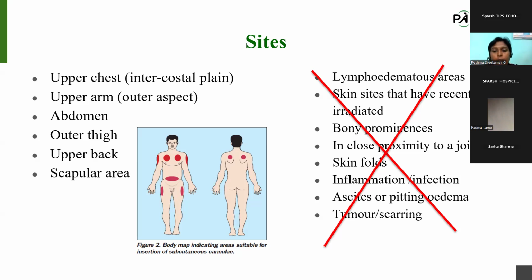In the abdomen, if the patient is experiencing ascites or pitting edema, it is not suitable for subcutaneous infusions or injections. And if there is any tumor or scarring, we will not choose that area for subcutaneous infusion either.